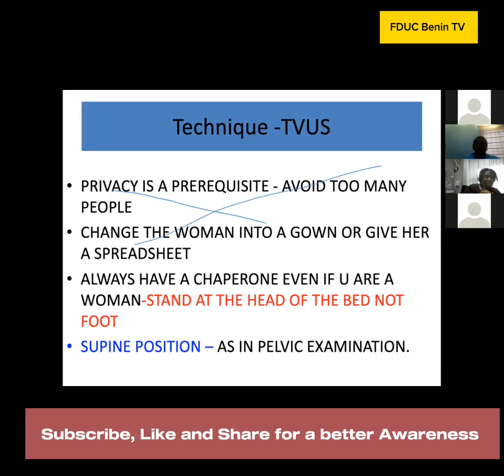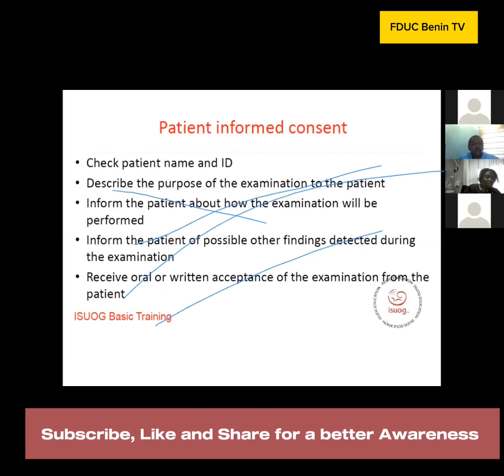You must always have a chaperone when you perform the scan, even if you're a woman. And your chaperone should not stand at the foot of the bed. They should stand at the side of the bed with you taking notes, or at the head of the bed. The position in which we perform the transvaginal scan is supine, as in pelvic examination.